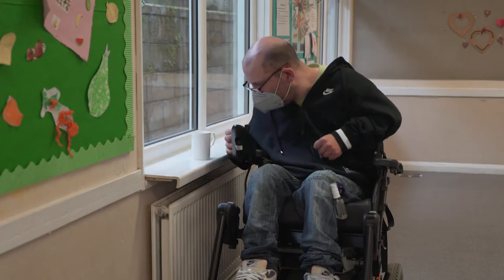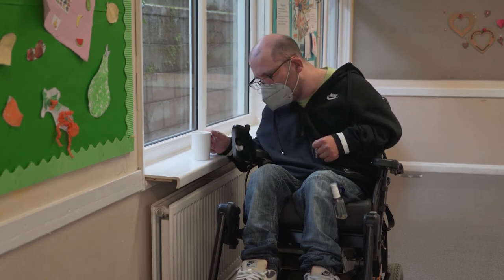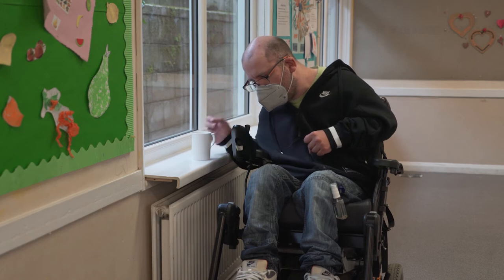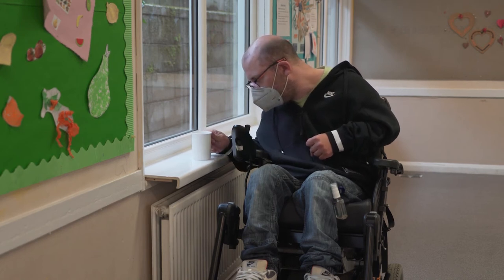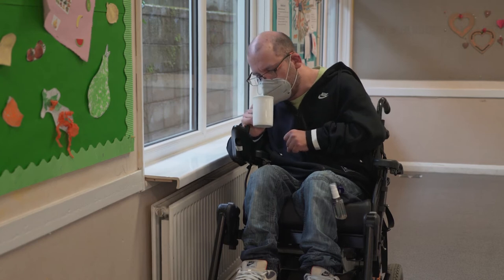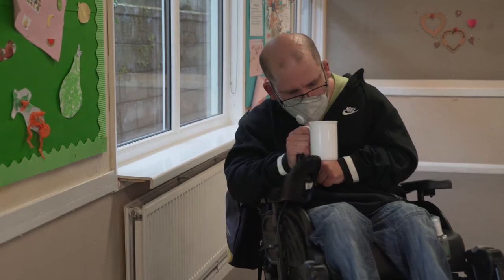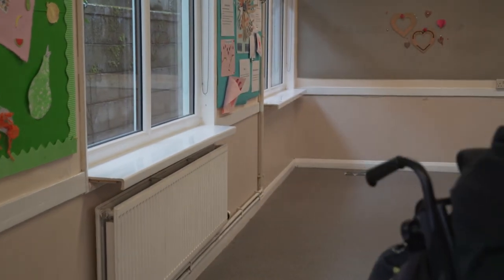Because I'm a person who can only use one hand, whenever I'm carrying a drink I make sure my speed is on the lowest, because the way I carry a drink I use that part of my hand to steer. So I make sure it's on the lowest setting so I don't jerk, and that works for me.